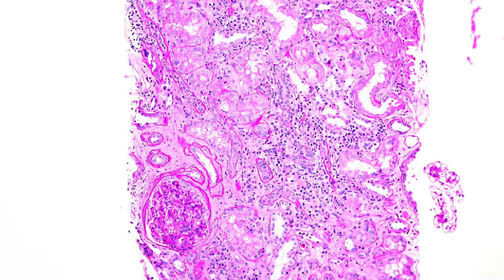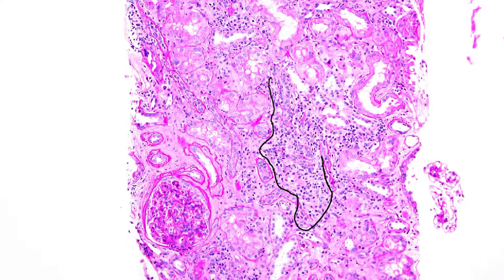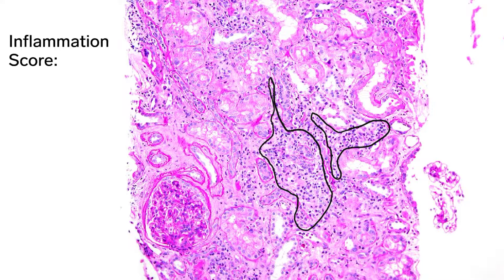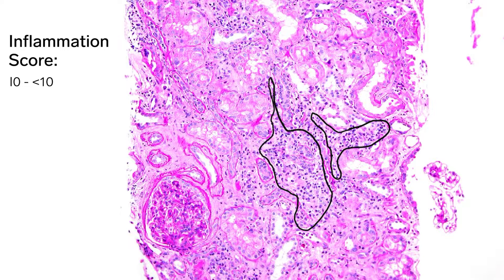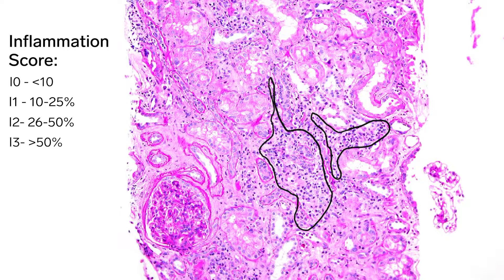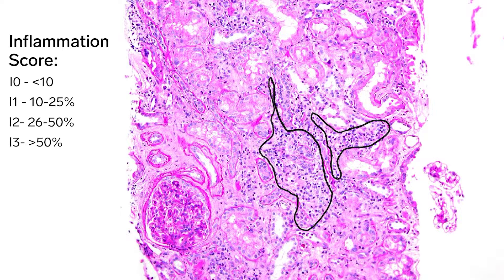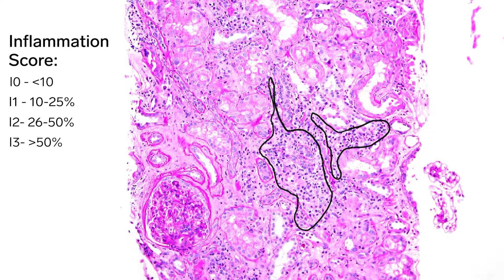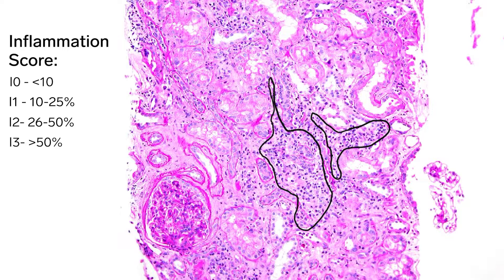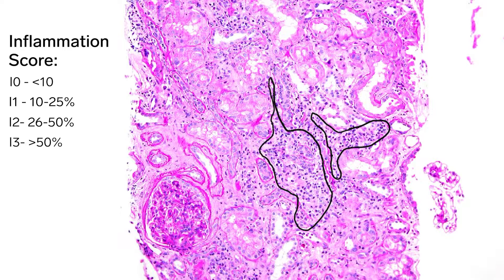This is a PAS stain section of the biopsy at medium power. One thing that catches your eye is a lymphoplasmacytic inflammation within the interstitium. When evaluating interstitial inflammation within an area of unscarred cortex, the scores are as follows: I0 less than 10%, I1 10-25%, I2 26-50%, and I3 greater than 50% within the non-scarred cortex. Here, there is inflammation within an area of unscarred cortex, comprising approximately 15% of the sample, meeting criteria for a score of I1.